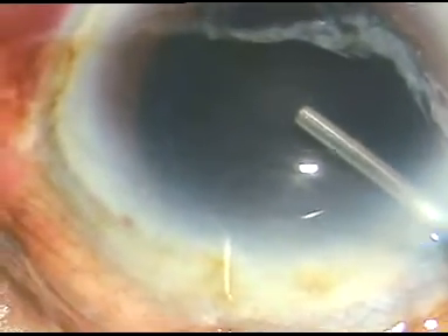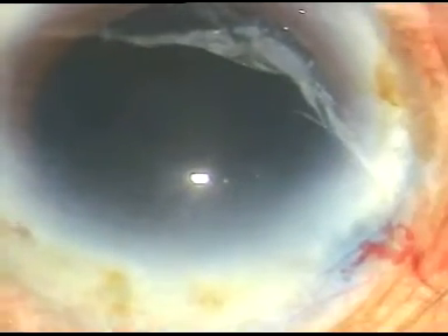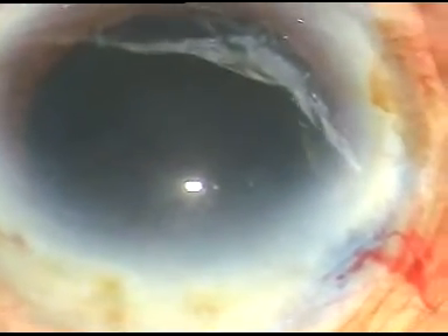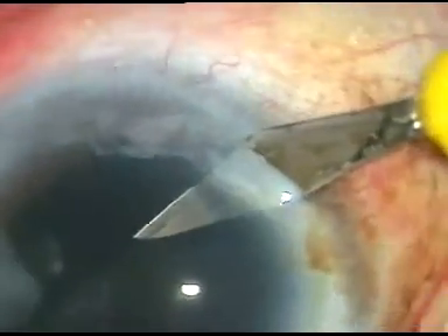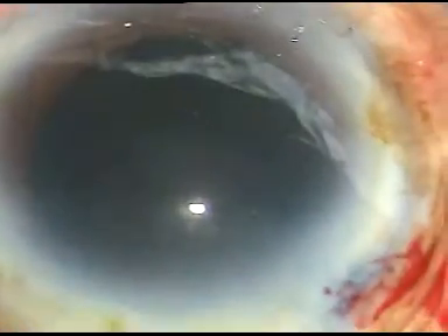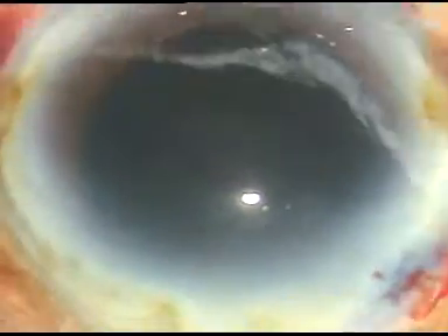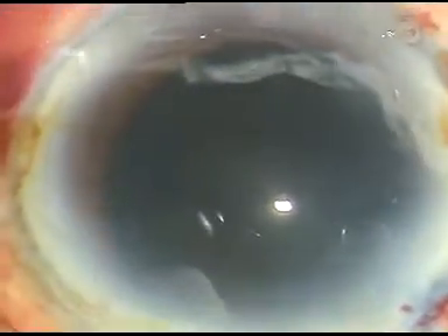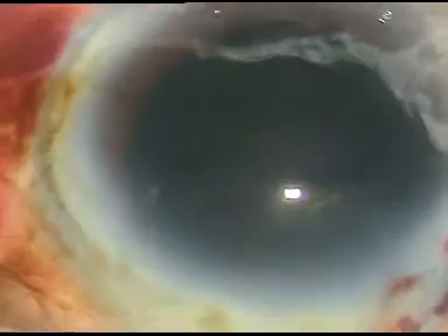The viscoelastic substance fills out the anterior chamber. Now another side port is made on the right side of the main incision, about 2.5 mm away. The anterior capsule is incised with the 26-gauge cystitome. A nice easy-to-hold flap is raised.